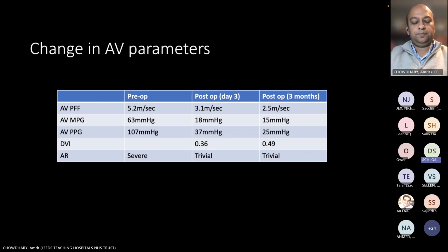Now, there are some theoretical things. You will see tables if you have fresh mobile stuff, and one of the images did show some mobility, I think, or mobile echogenicity. That's more suspicious of a thrombus, and often the pannus is a little bit more slowly progressive. And this guy, I think, presented fairly acutely. And interestingly, he intermittently went into pulmonary edema when the valve got completely stuck, and then it sort of loosened up again. So it was quite a scary moment, actually.